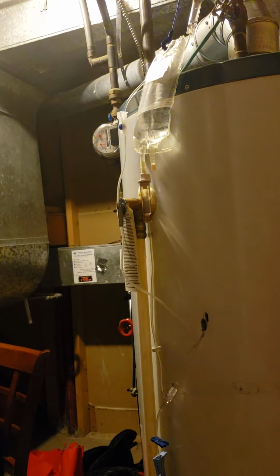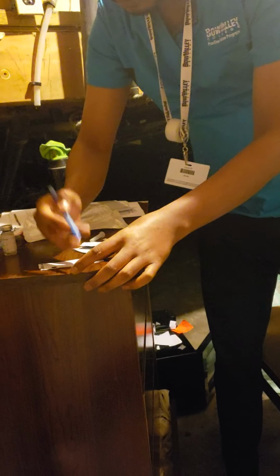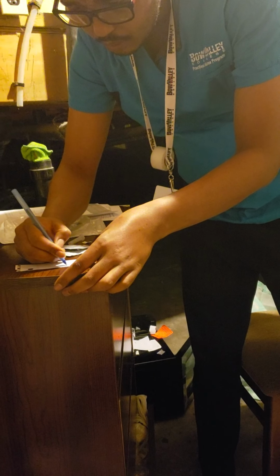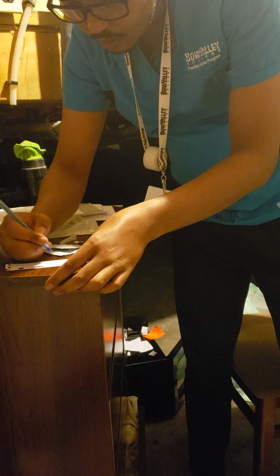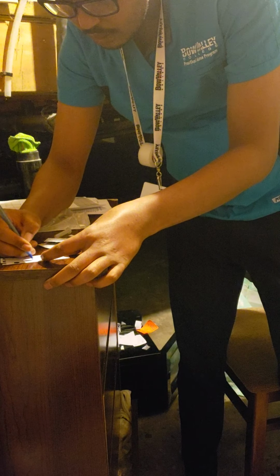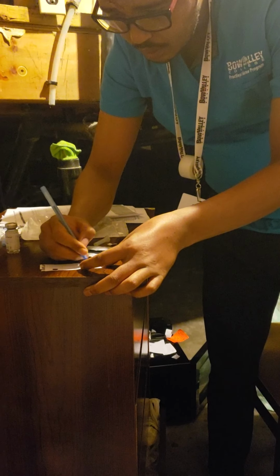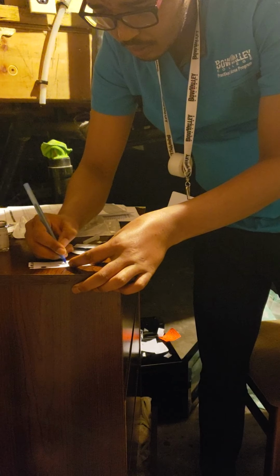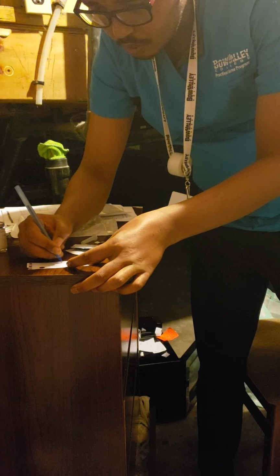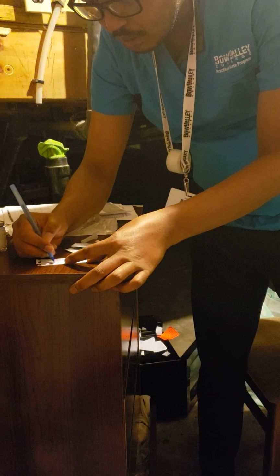So I have to write down the secondary IV line. The date is June 20, 2020, and time is 9 in the morning. The line is secondary. Solution is 0.9% sodium chloride, normal saline, and my initials, Ibrahim Adam.